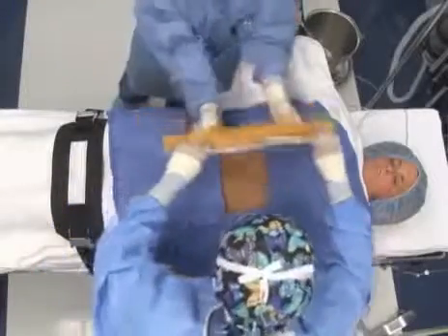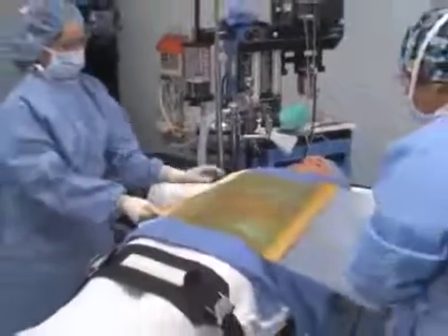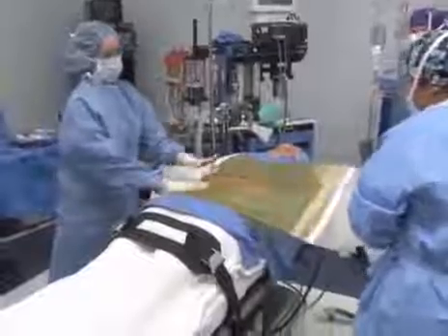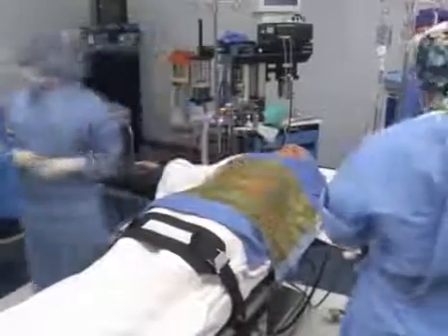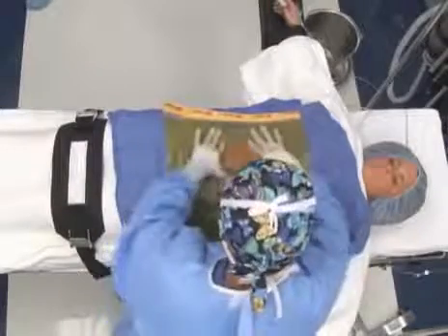The sterile incise drape is coated with adhesive on one side and may be impregnated with antiseptic. The drape is packaged with a paper backing on the adhesive side. The whole drape, including paper backing, is then folded lengthwise and contained in a plastic sleeve wrapping. During draping, the paper backing is peeled away while the drape is applied. This is done in a way that prevents the drape from tangling and sticking to itself. The surgical technologist and surgeon usually apply the drape together.